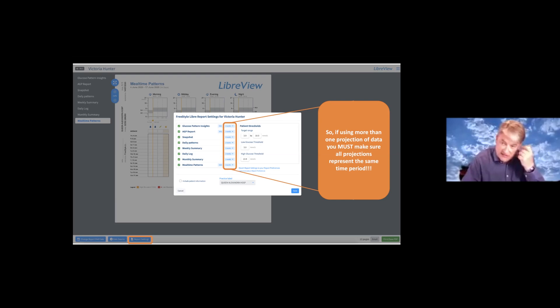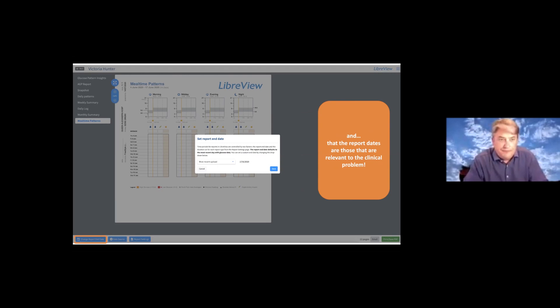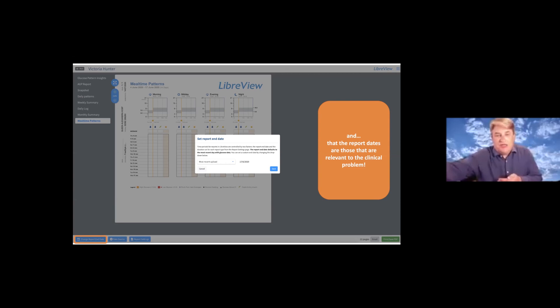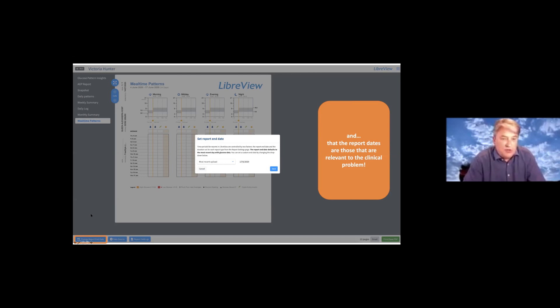If I don't want to use the pattern insights I can just tick off that box. But perhaps more importantly: given I have this wide selection of screen options, it's really important to make sure if I'm going to use more than one screen option in the analysis that they are all set to the same time period — if you have one set to one time period and one set to another it can become problematic when you're trying to interpret data. It's always important to check at the beginning of a session that those are set to the same time period. You can also check the report end date — it defaults to the most recent upload data.